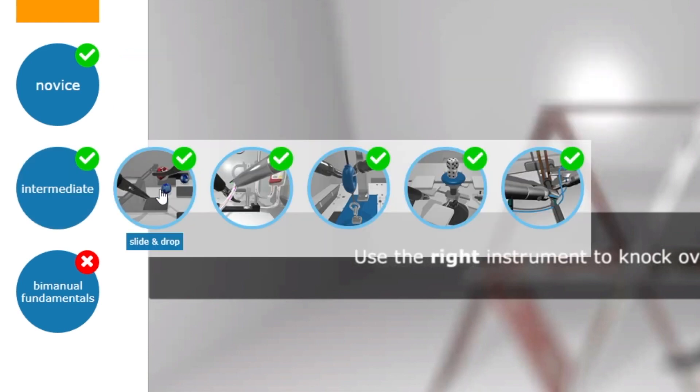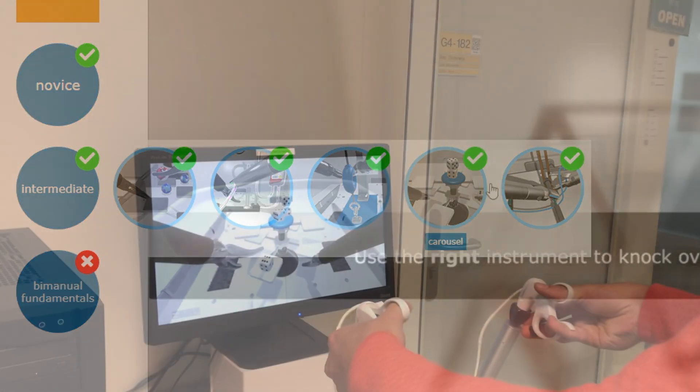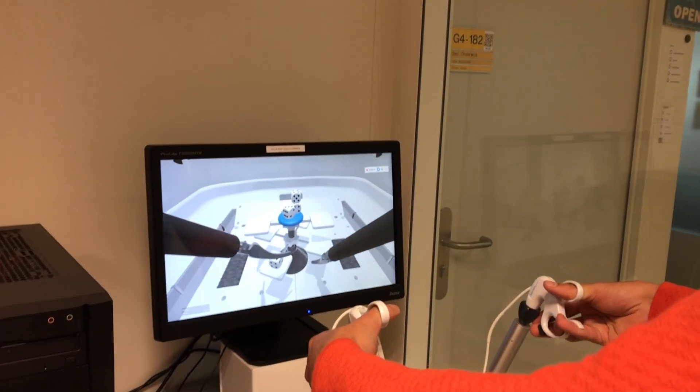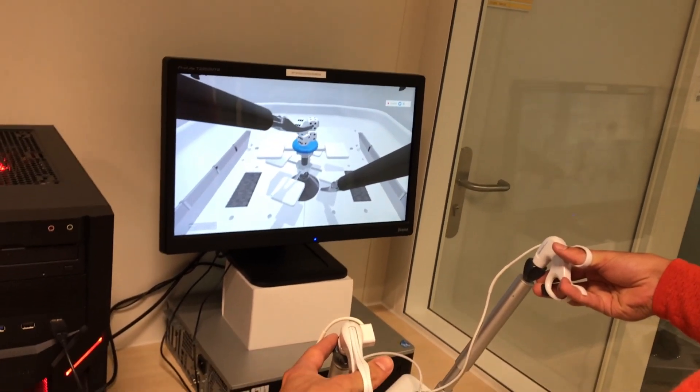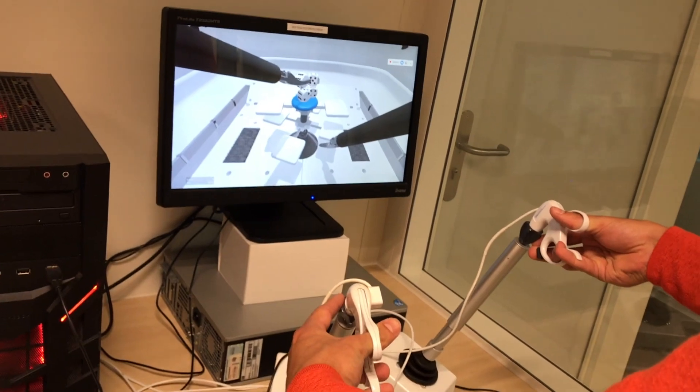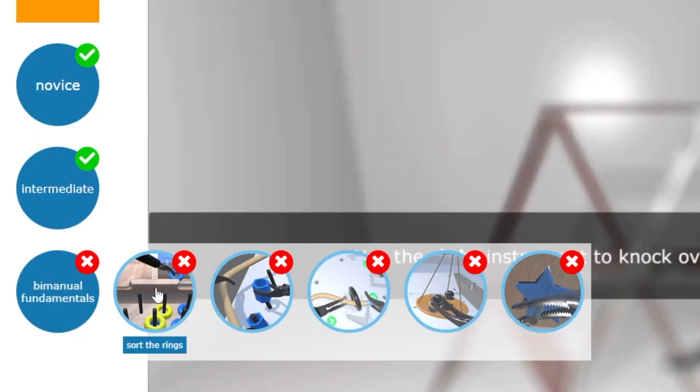The intermediate exercises focus on working with both hands at the same time and the fulcrum effect, but also just generally complex tasks. I find this one quite difficult.